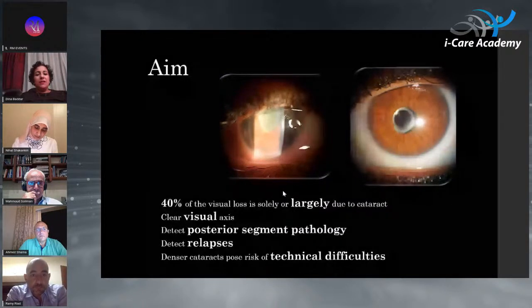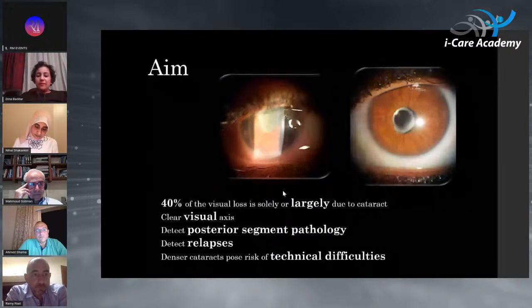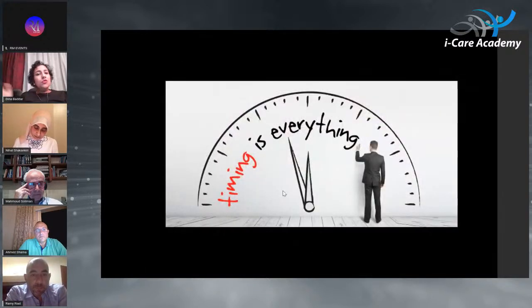Okay. Any tips and tricks when you're tackling that? We do put a viscoelastic shell all around the nucleus, so that it cushions its movement. Okay, excellent. All right, now we come to timing.